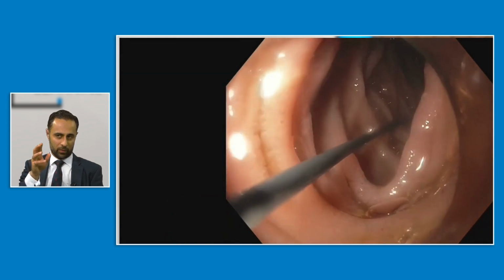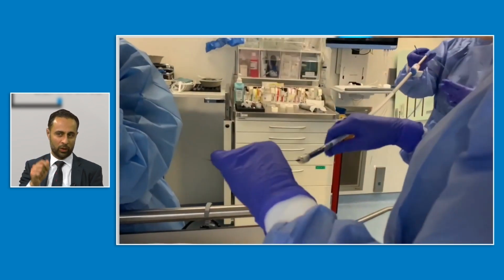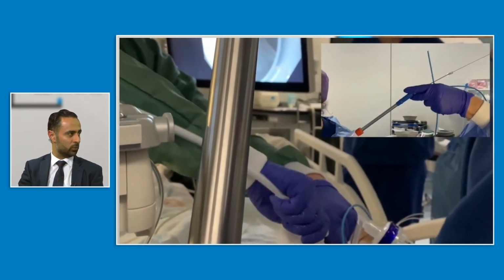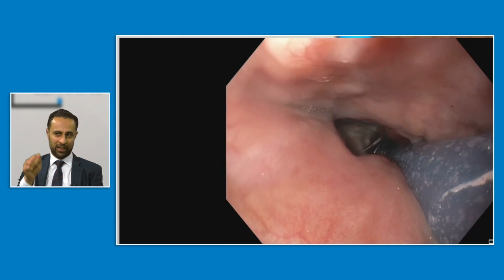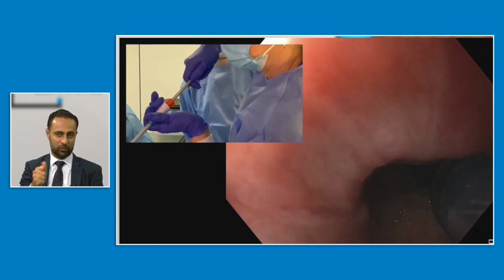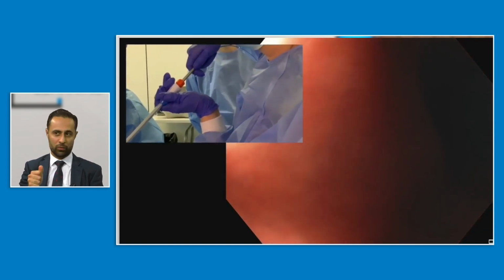So they've deployed the stent over a wire. You have to be pretty careful with your markings here. You actually want to have your scope side by side when you're deploying the stent. And if you've got the benefit of radiological support as well, they encourage you to use that. So really the key here is you want your sponge to cover the defect. And remember, the sponge is 5 centimeters. So any defect bigger than that is really going to be a contraindication for the sponge.